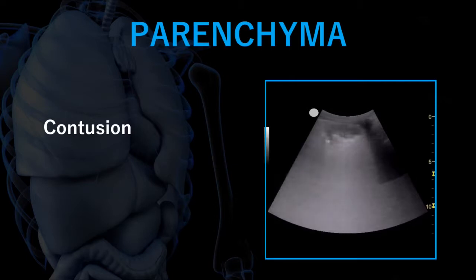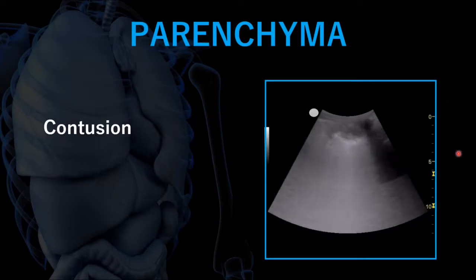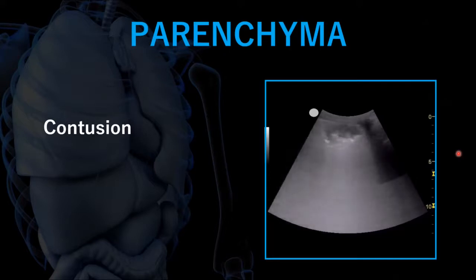We've talked about thoracic wall ultrasound and pleural ultrasound - now we can talk about the lung tissue itself. In this image, again we have the layer of skin, and this structure here is a little bit of consolidation that we can identify in the lung tissue itself - so this is now below the pleura. It's a peripheral consolidation, and in this situation, if it's next to a rib in the area of trauma, chances are that's going to be a contusion - bruising and bleeding into the alveolar structures.